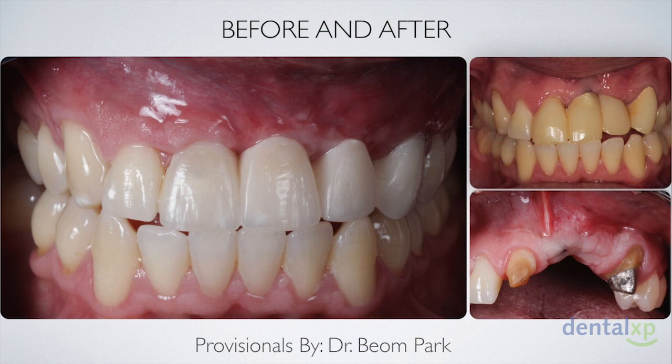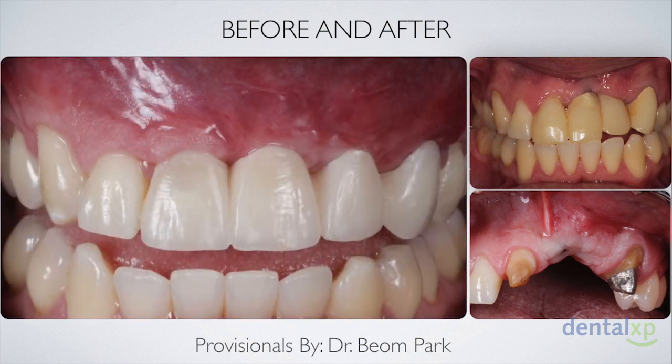also with some clefting on the papilla between the right central and lateral incisors. However, what we were able to accomplish in this case is augment a largely deficient site in the anterior maxilla in a patient with a high lip line, in which if we had gone for pink porcelain, we could have very well had the challenge of being unable to mask the interface of the pink porcelain with the edentulous ridge. So our augmentations were not only aimed at the aesthetic outcome, but also for long-term functional and tissue stability around those implants.